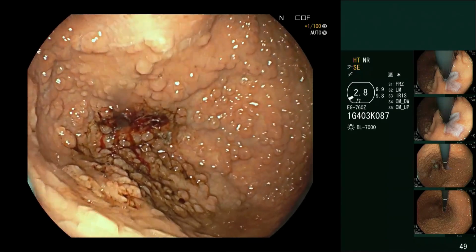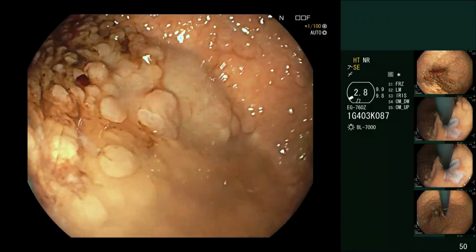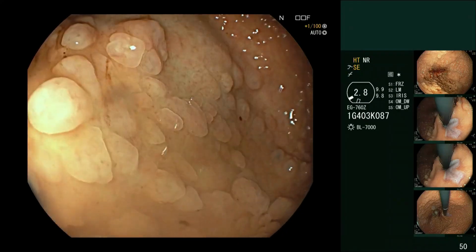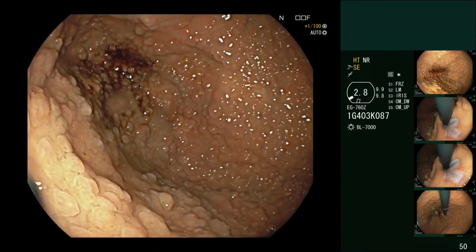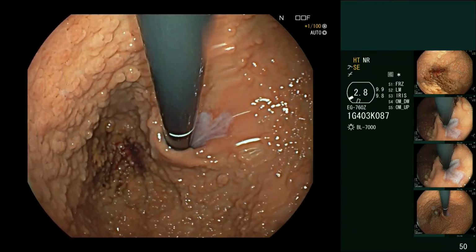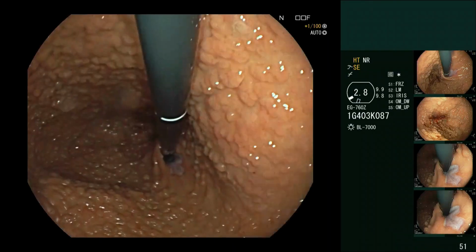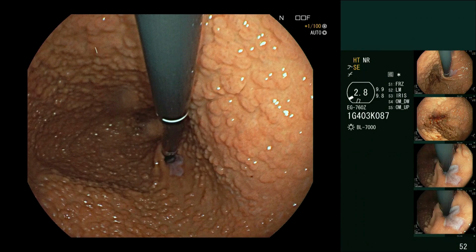Again here, go right up into the fundus, distend it properly, and remove any fluid. If you need to remove this, it's pretty clear. So clear fluid, okay, but any other fluid, not. Then push the scope right in, and we describe this kind of spiral movement where, as you come down, you spiral the scope around to have a look at these lesions as you come down.